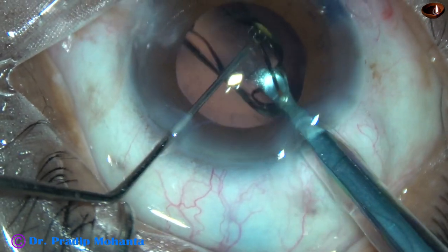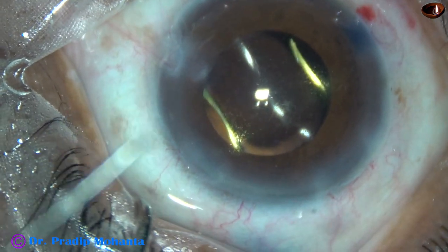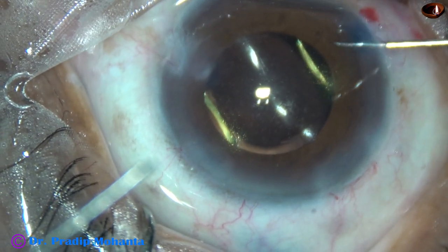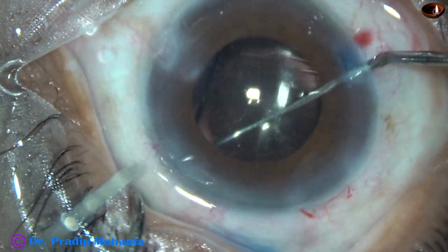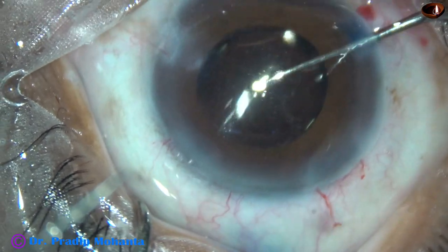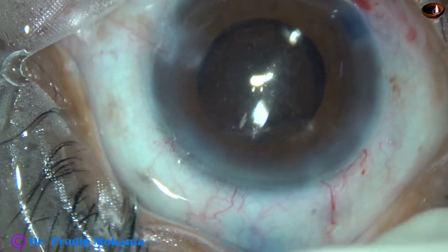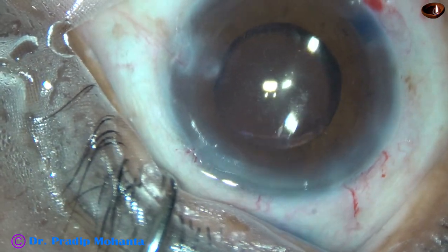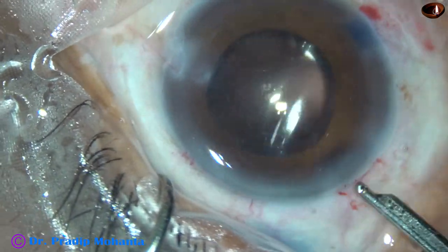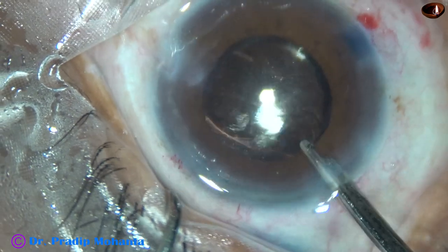Here goes the intraocular lens. This is Galaxy Fold, that is Super 4 from Appasamy Associates. It's a beautiful lens. I have no financial interest — I just bear sincere gratitude for Appasamy Associates. This is a company which has helped Indian ophthalmologists grow wherever they are today.